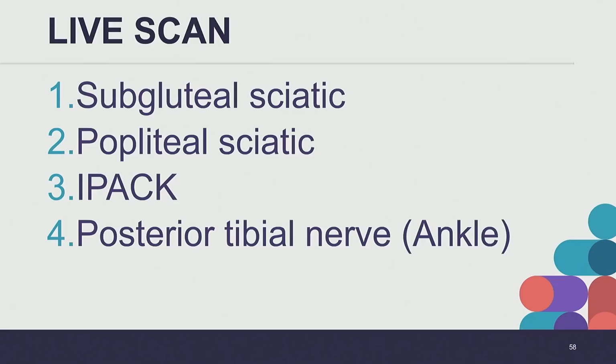There's a great view of the sciatic nerve block. So in terms of the needle approach, we're coming in lateral to medial like this, and then you pop. Treat it like a fascial plane block where you're going between two muscles, right? So the gluteus maximus, the quadratus femoris. Never just skewer through that nerve. Either go on one side or the other of the nerve, and then inject that local so that you see spread either going over or under the nerve itself.